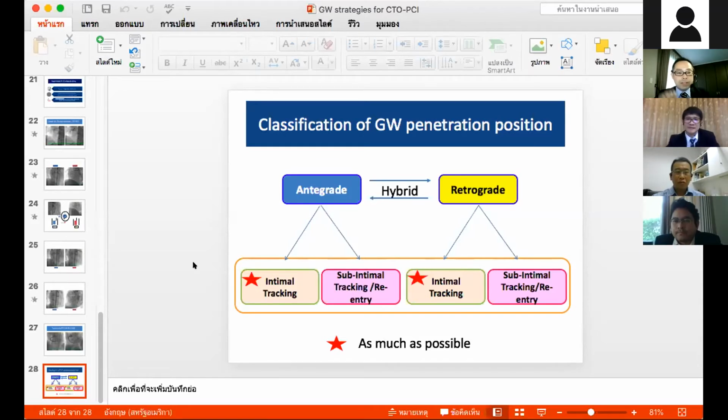Anyway, each guide wire can make a knuckle shape automatically. The difference among those guide wires is the pushing power. With a harder tip load we can push more, but automatically and simultaneously the perforation risk increases. Usually my recommendation is to please start from the Sion black. Thank you. I see. Thank you very much.